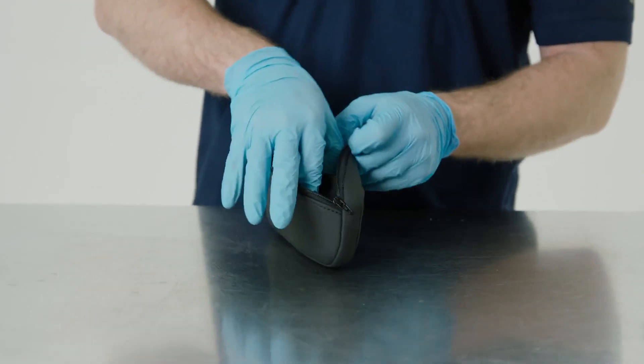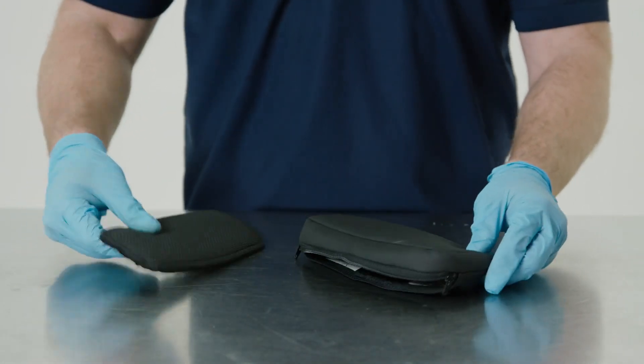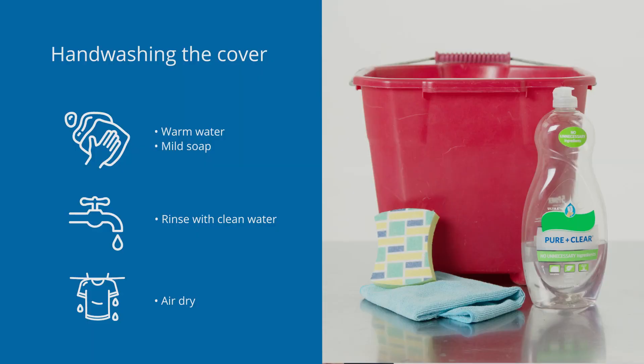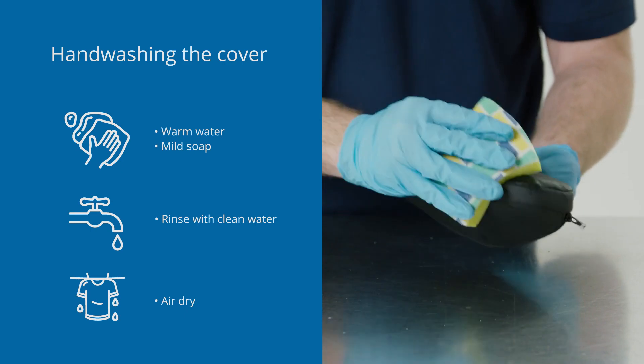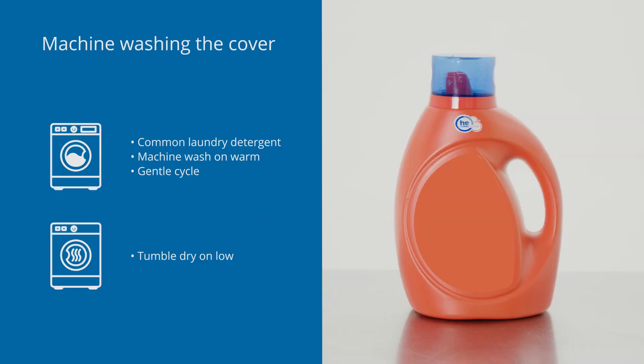For cleaning the covers, remove inserts from the covers first and hand wash in warm water with mild soap. Rinse thoroughly with clean water and air dry completely before use. Alternatively, machine wash the cover in warm water with common laundry detergent and tumble dry low. Remember not to steam clean, autoclave, or iron the cover.